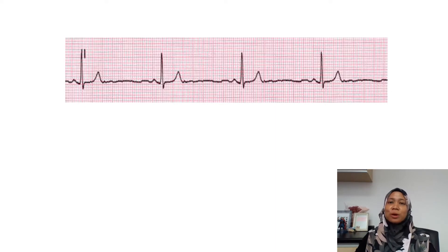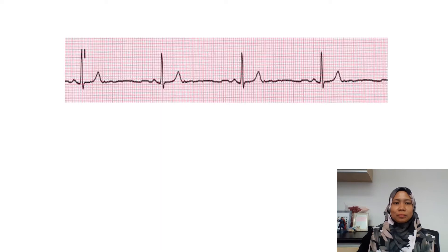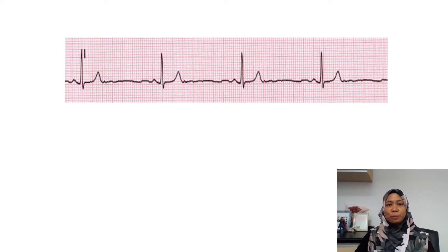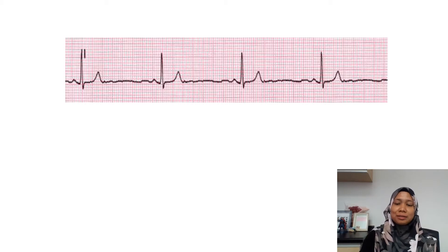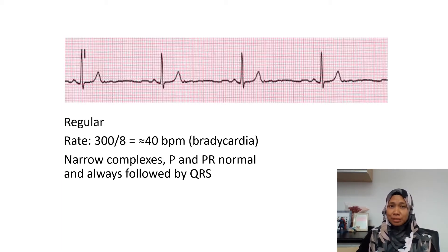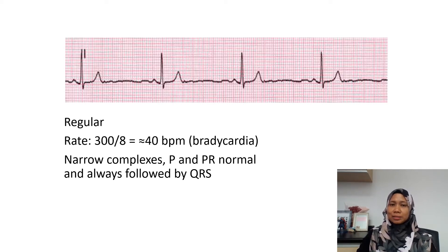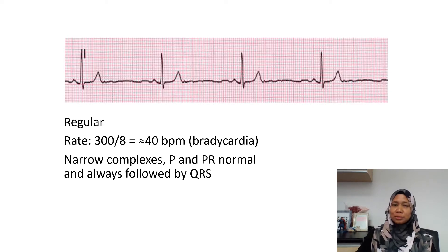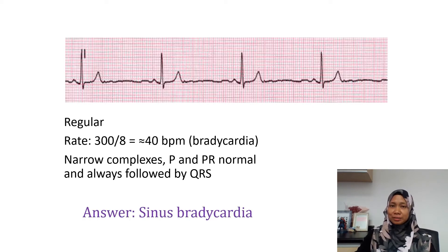So let's see what we have here. We have a regular rhythm with narrow complexes. However, the rate is slow, which is about 40 beats per minute. So this is a bradycardia. Otherwise, the other things look normal. So this is a sinus bradycardia.